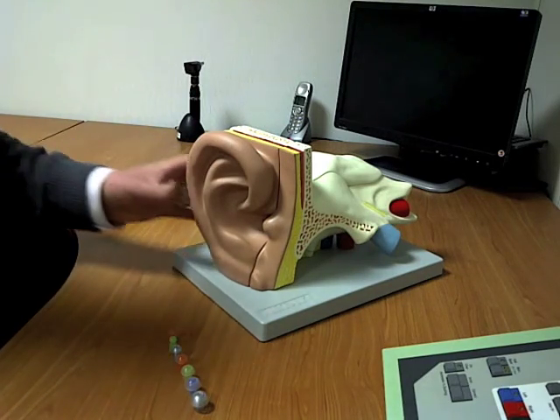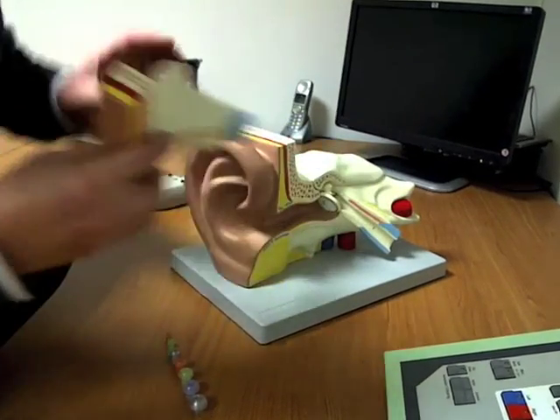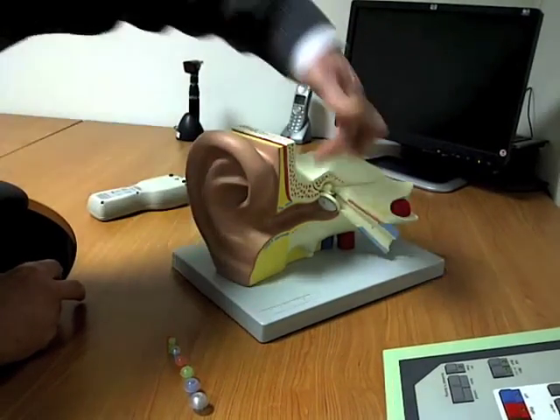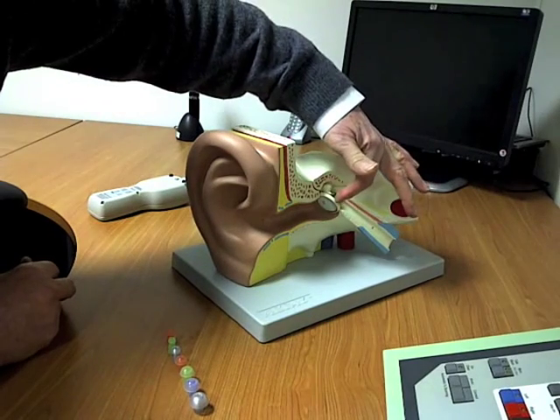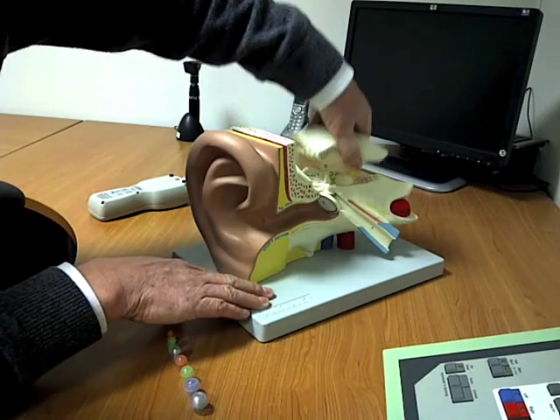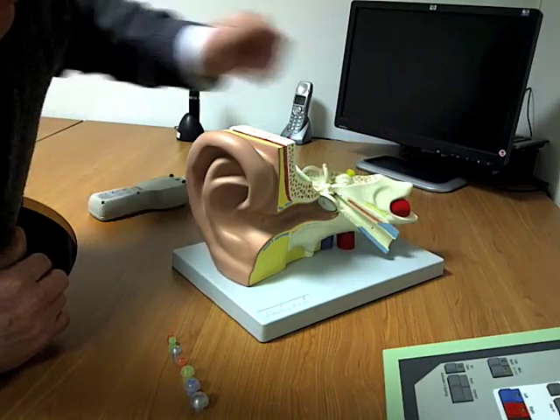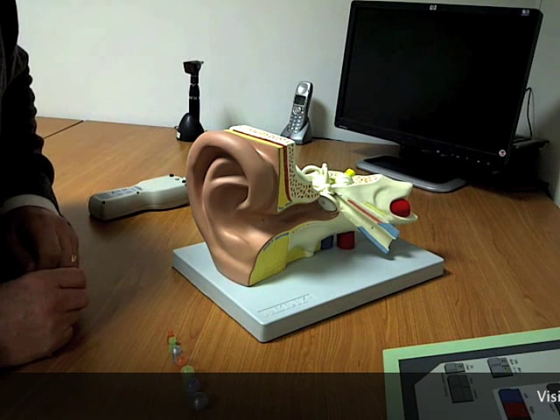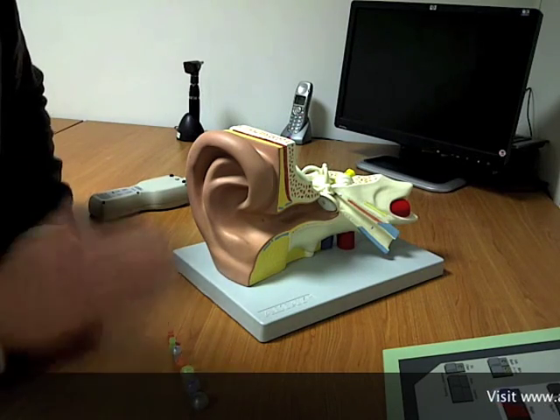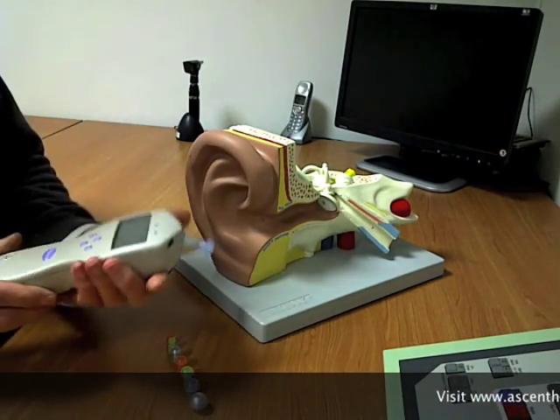The idea with the tympanometry test is to assess how well the sound waves entering the ear canal go down to the tympanic membrane, set that into vibration, and then those vibrations are passed across the middle ear behind the drum to stimulate the nerve. So tympanometry is a simple measure of the efficacy of sound transmission from the outside into the nerve of hearing.